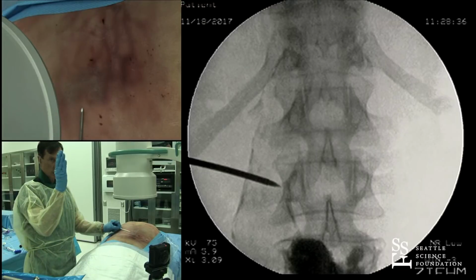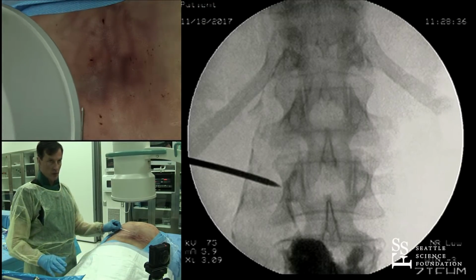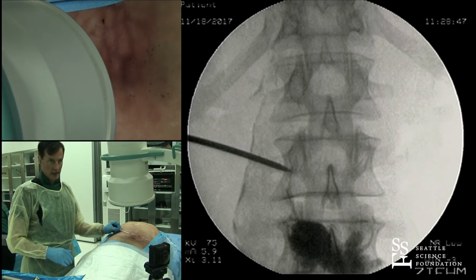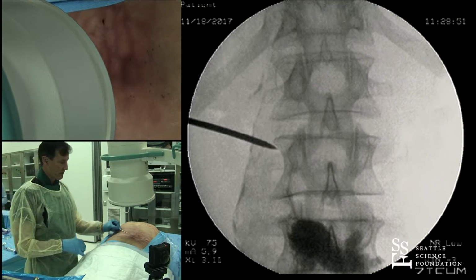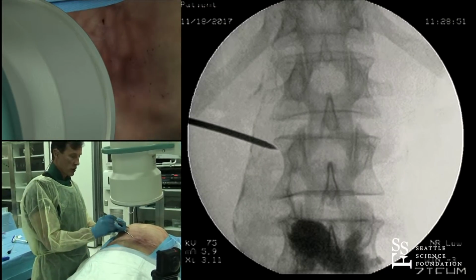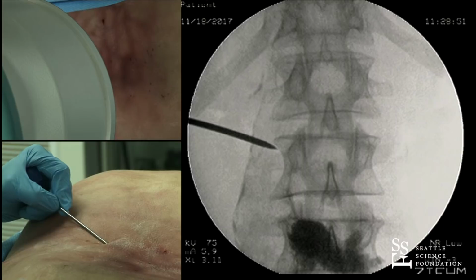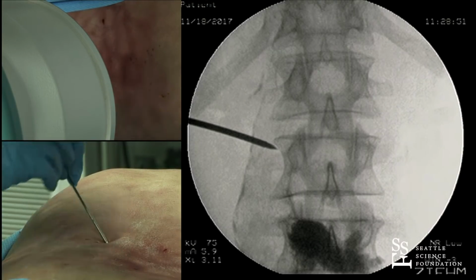We're going to come a little caudal, please. He's pointing right at the vertebral body. A bit more. That's right where he was pointing. And with the Kiva approach, you want to have that in your mind when you're looking at these views. This is kind of a different approach. This is more of a transpedicular approach, and this is a very flat approach. This will go from top to bottom, which is how this implant is deployed. It's deployed over a nickel titanium, a nitinol wire. And so we have a left pedicle.